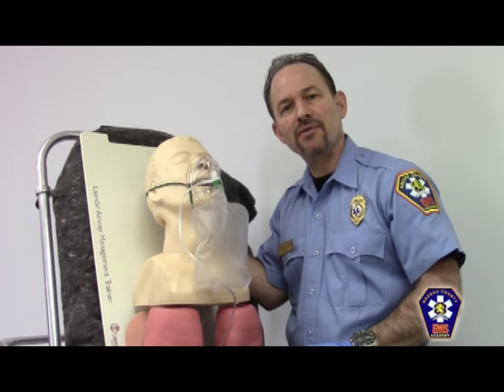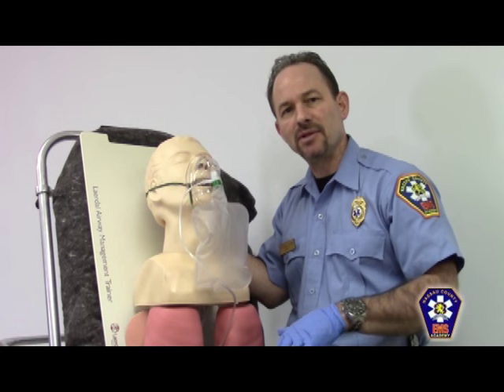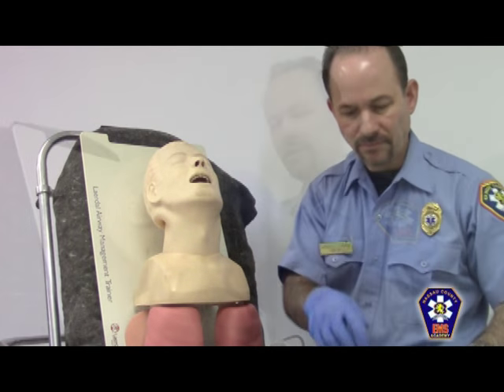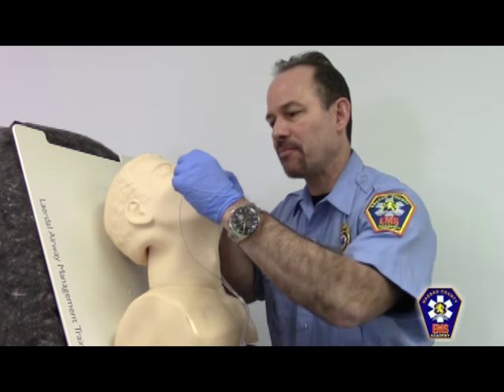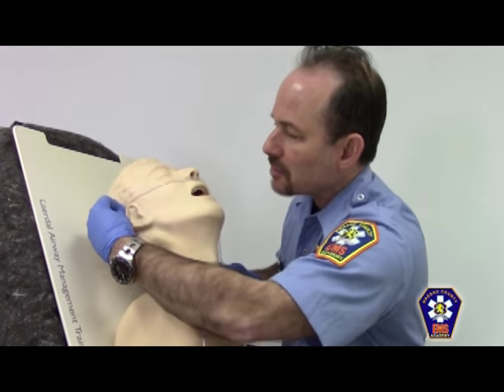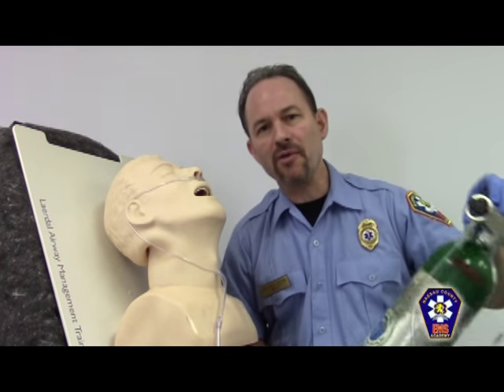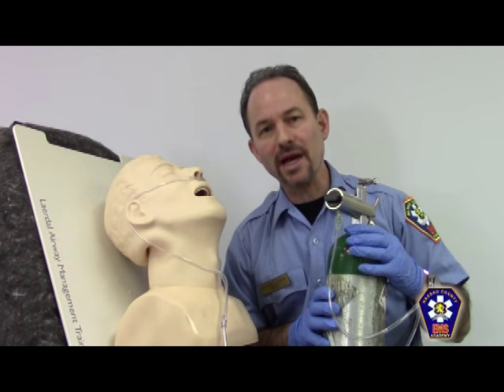Being that my patient is having difficulty accepting this mask, I'm now going to remove the mask from the patient and switch to a nasal cannula. To attach the nasal cannula to the patient, first start by placing the prongs within the nasal nares, wrapping it around each ear, and then securing it in place by snugging up the lasso. The oxygen flow rate from the oxygen tank should be six liters per minute or less.